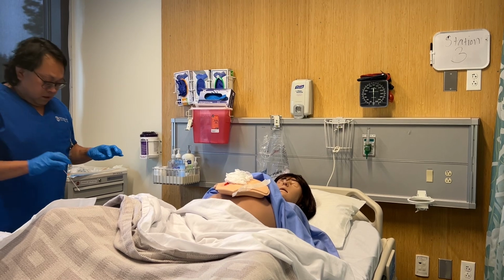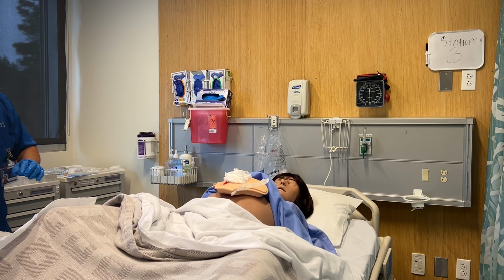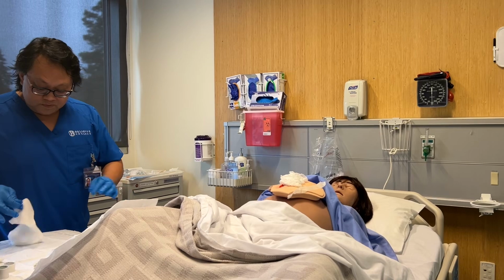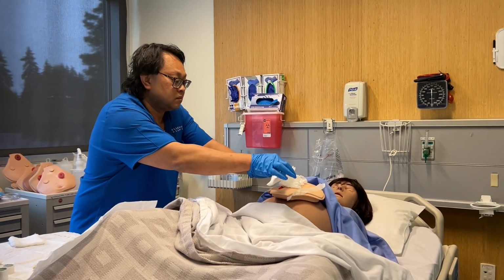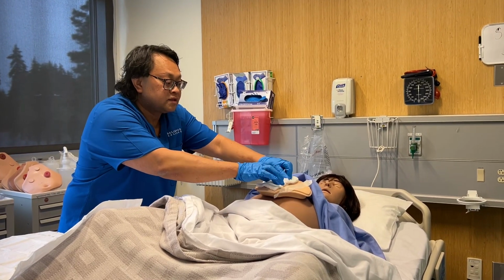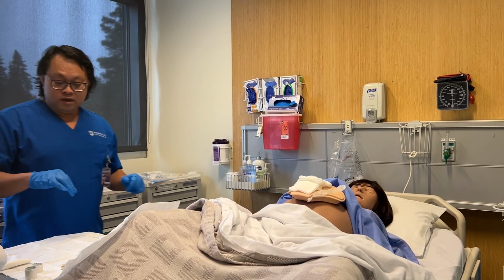You're not in any pain, Mrs. Smith? No? Okay, you're doing very well. And we're going to pack it nice and neatly and firmly onto the skin. Great. And now we are going to put the gauze on, making sure it's 1 inch away from the wound so it can be covered well.